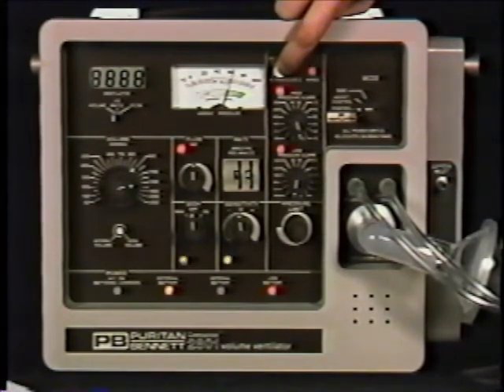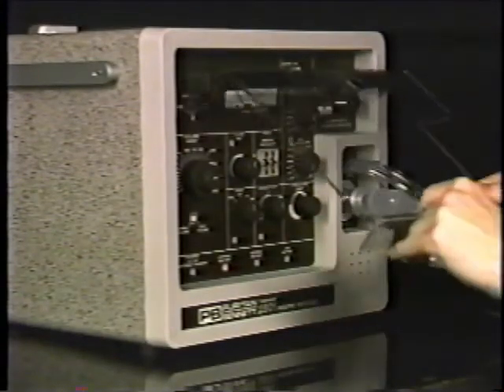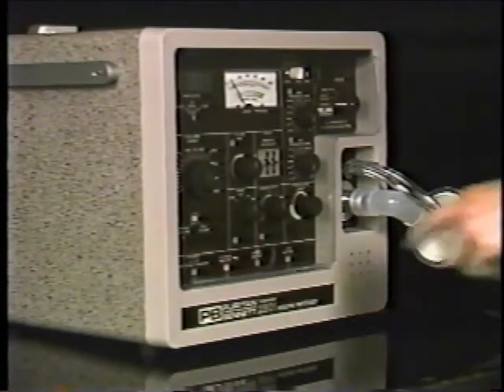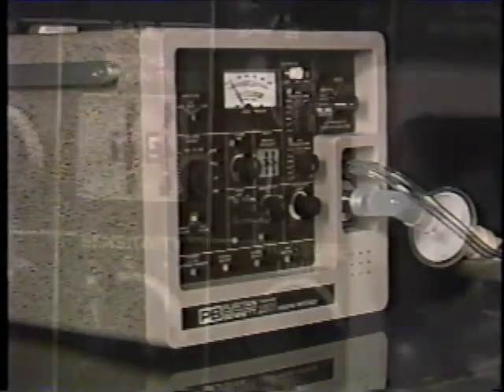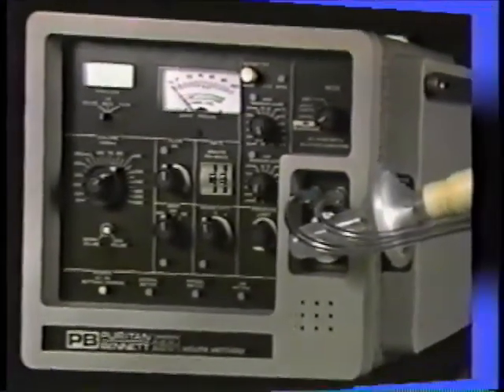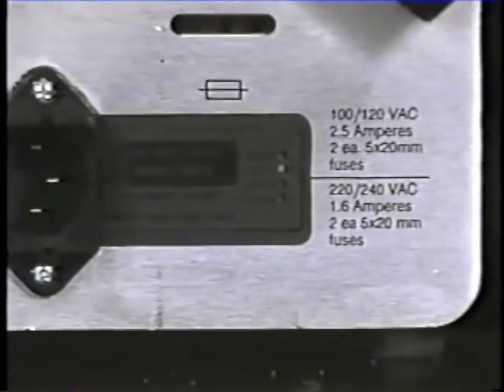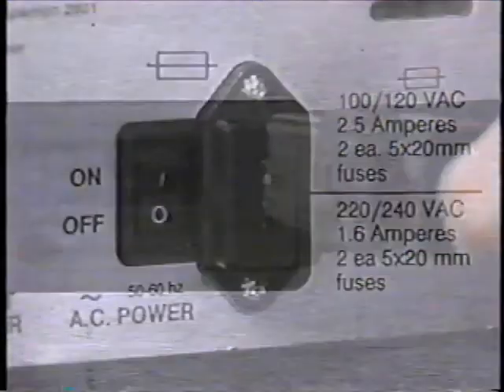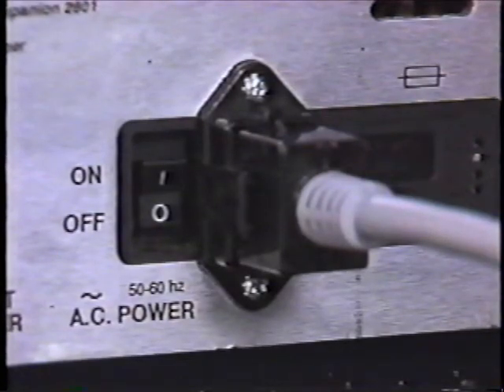of the ventilator display. To help prevent accidental changes to control settings and to protect the control panel, a clear Lexan cover is provided. The cover can be quickly removed from its Velcro-type fastener for access to the controls. Before connecting the ventilator to a patient, always confirm the reliability of the power source. The AC power module is located on the rear panel. Next to the AC power switch is the line voltage selector and the AC line fuses. The AC power cord is detachable from the unit. However, latching connectors have been added to avoid accidental disconnect.